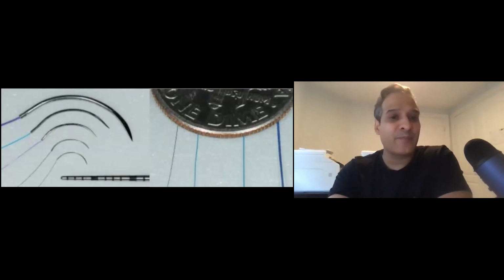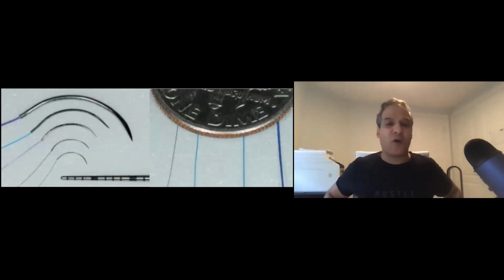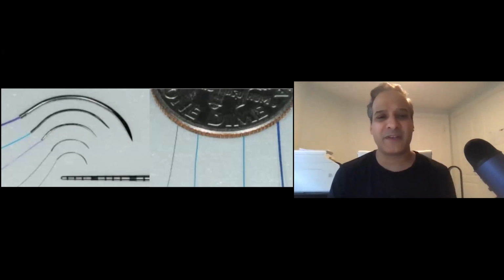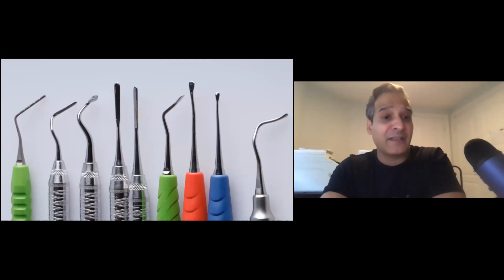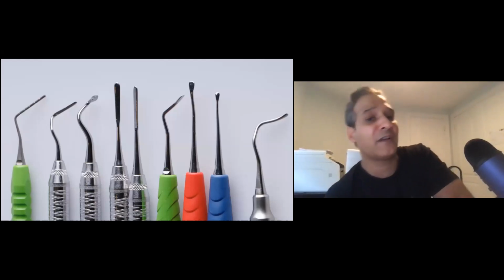Sutures, we mentioned, again, the smaller gauge, the better. In general, I personally, for tissue grafting, will use between 6 and 7/0. I don't go smaller than that unless it's something very tiny, but 6/0 and 7/0 are good enough. As you're starting out, you can use 5/0s, and then as you get better with your suturing and have a little more manual dexterity, you can graduate up to the 6/0s and 7/0s.